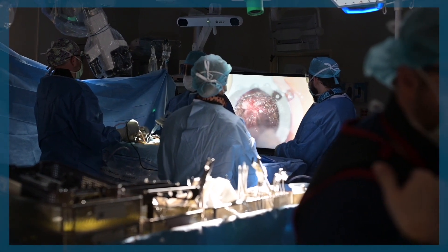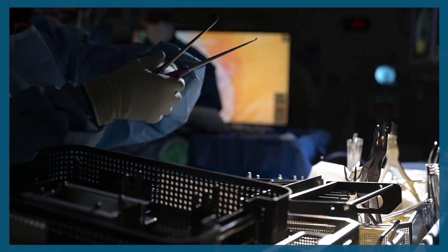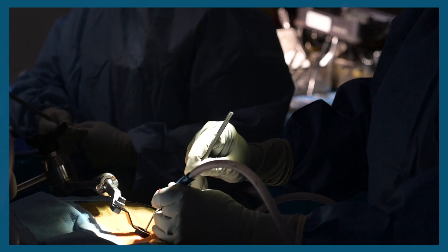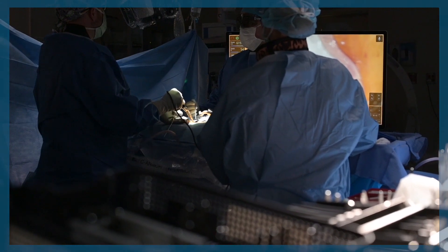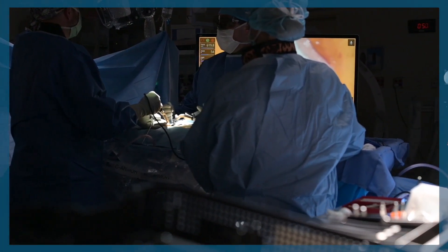It also makes it a lot easier for everyone in the room to see the surgery — for your scrub nurse and the circulator to anticipate what needs to happen next. You find that your scrub nurse is able to see what the next steps are in the surgery, and he or she will just start handing you instruments without having to ask for them because they know the upcoming steps. That's not always possible with the traditional microscope. So it really builds a team environment in the operating room and allows you to more efficiently and safely take care of the patient.